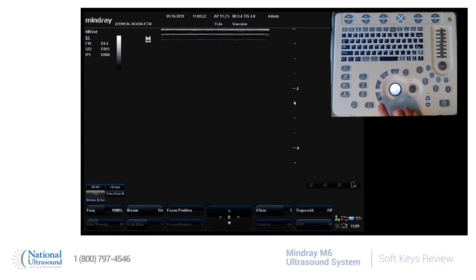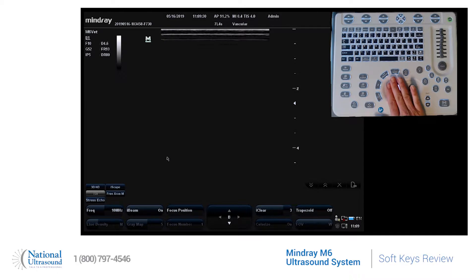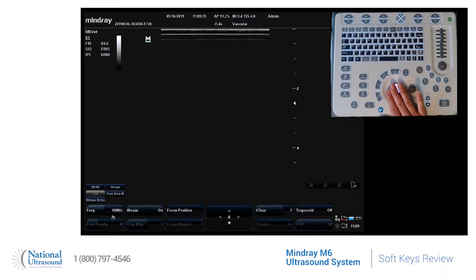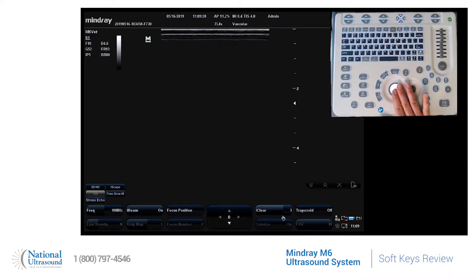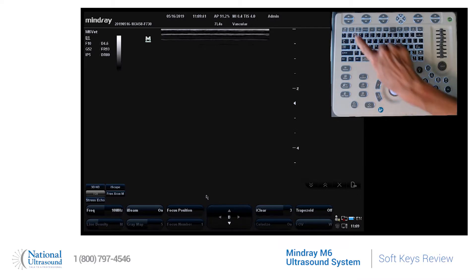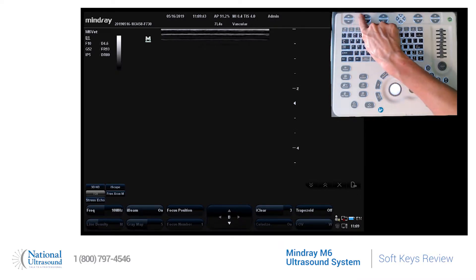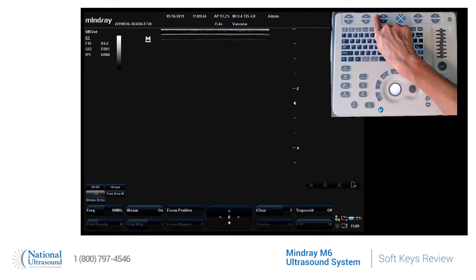Let's look at the soft keys on the bottom of the scanning screen and see how to make adjustments to those. If you do not have a white arrow that appears, you can press this cursor button. These are the soft keys and these are on the bottom of your scanning screen. They are controlled by the buttons right below each of them.